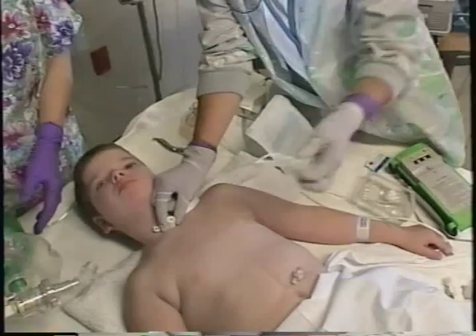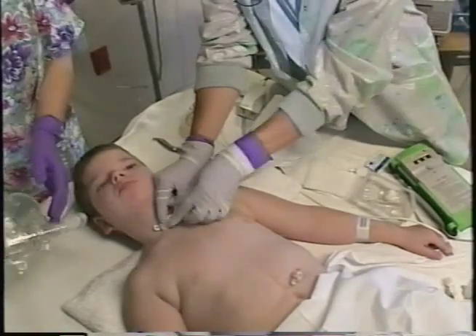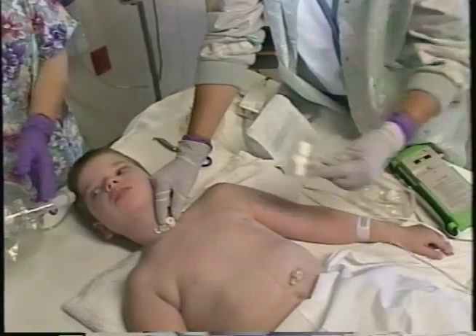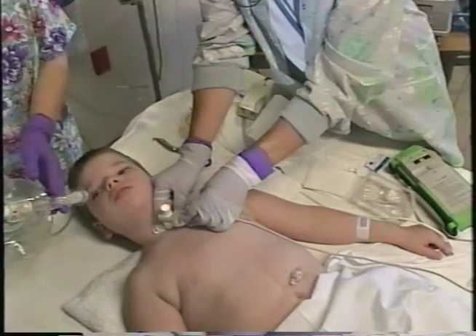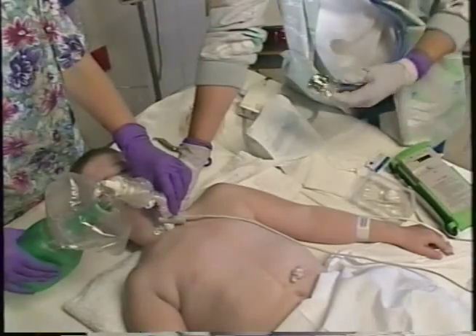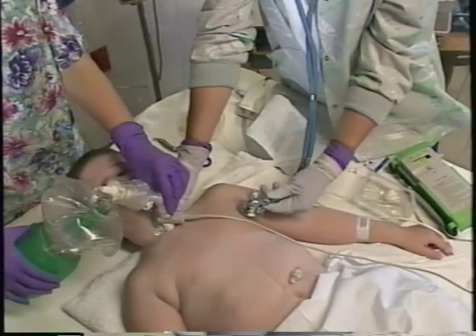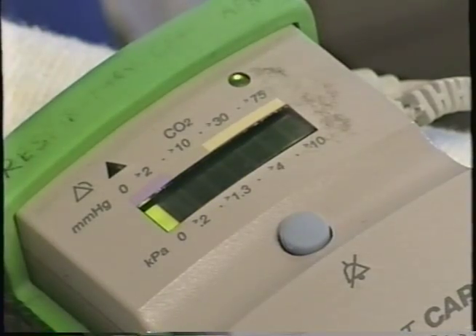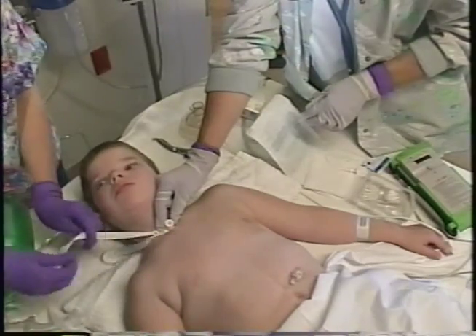During proper placement, you should feel little to no resistance. Once in place, manually ventilate and confirm tracheal tube position by chest movement, breath sounds, and, if appropriate, pulse oximetry and exhaled CO2 detection. Then secure the tracheostomy tube in place.